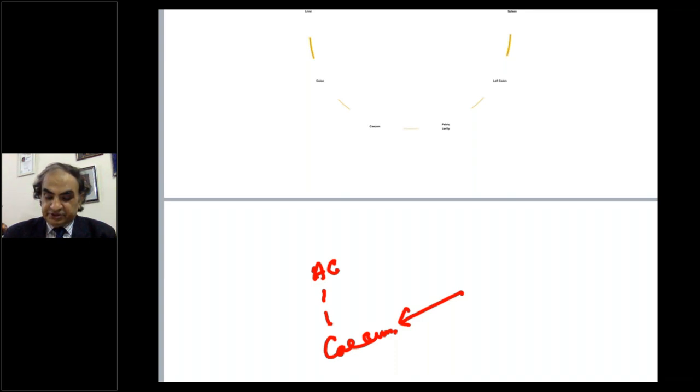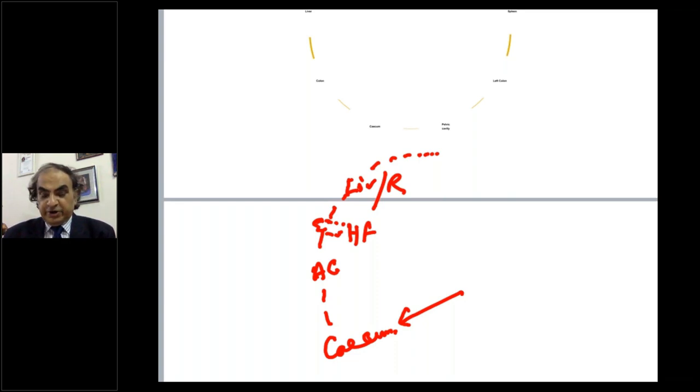Patient is getting 15 degree reverse Trendelenburg. Then I'll see the liver, which lobe? Right lobe. And in between, I'll see what? The hepatic flexure. Then I'll go right up to the falciform ligament. Now, what do I do here? I'll have to get the scope out. Don't negotiate it with the scope.